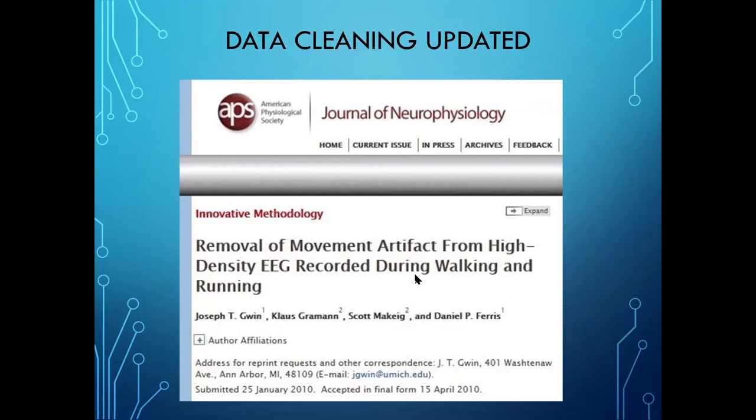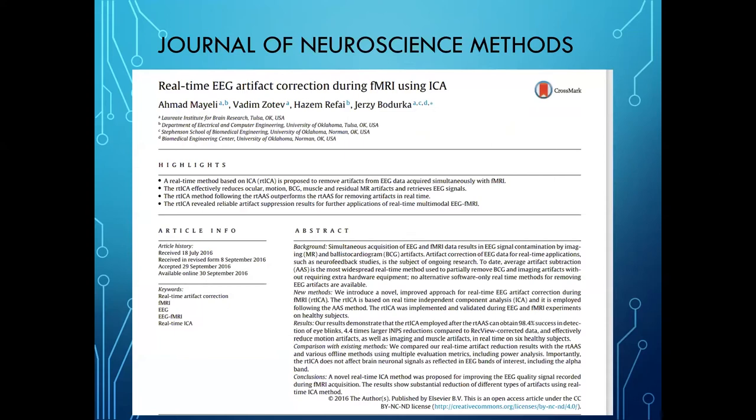People have found the ICA to be an acceptable form of cleanup. Not everybody agrees, obviously. However, if you look at the publications in neuroscience, ICA is pretty much ubiquitous. Real-time de-artifacting during an fMRI, using ICA to take out the fMRI pulse, but also things like eye movement and muscle.